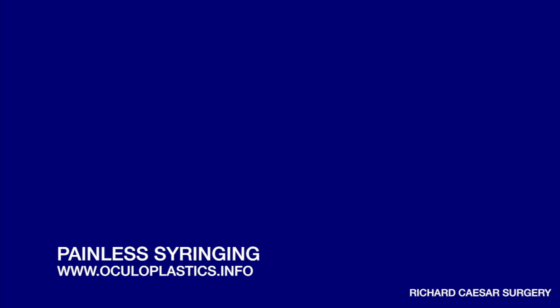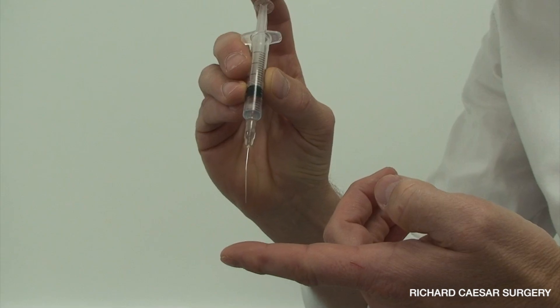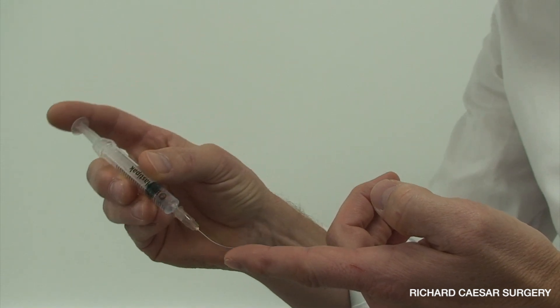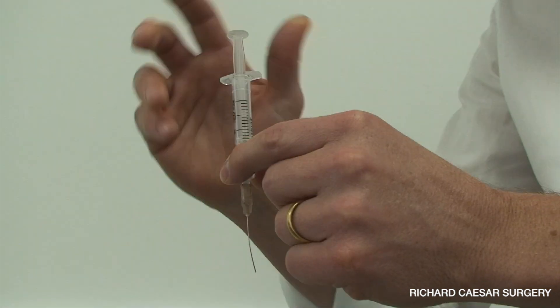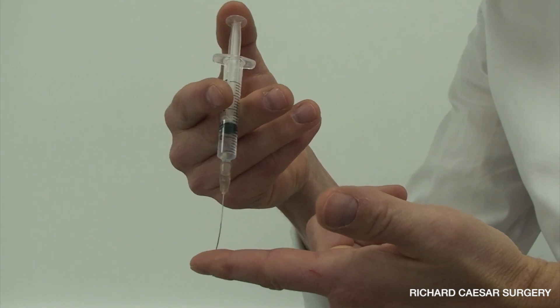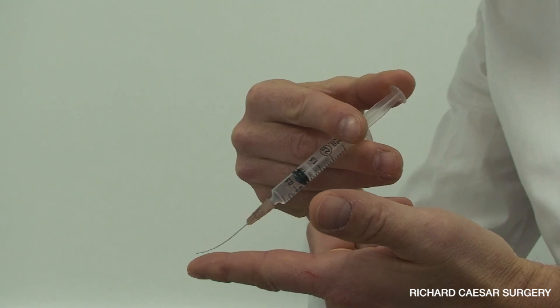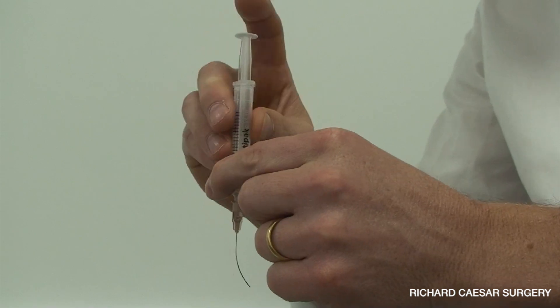The aim of all syringing should be to diagnose the obstruction in a way that is as pain-free for your patient as possible. A technique offered here involves standing behind the patient who is seated in their chair, then using your understanding of the way in which your hand pronates and supinates in order to change your grip to enable you to pivot effortlessly around the most inferior point of the ampulla.